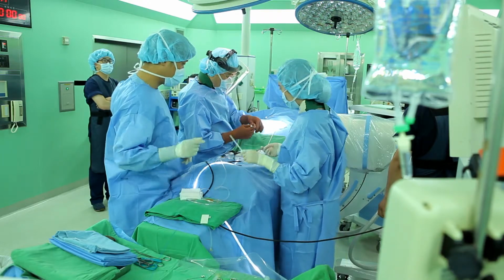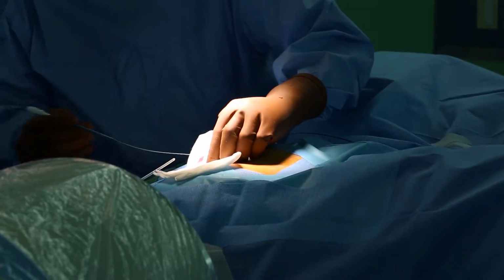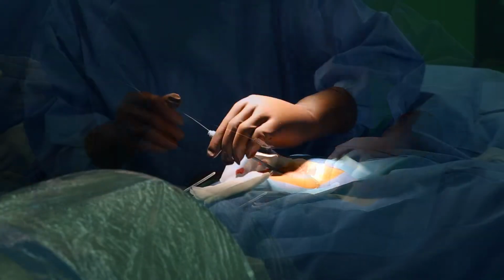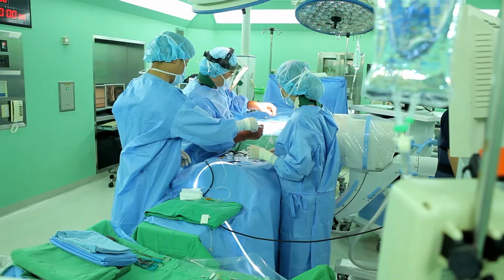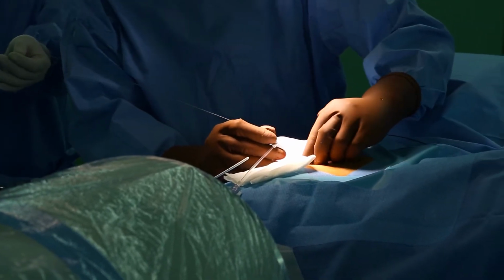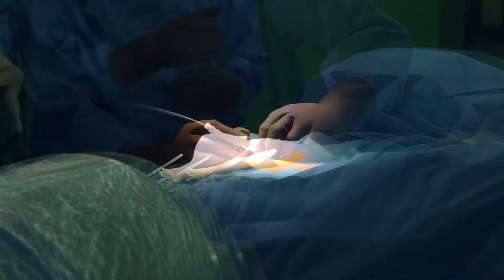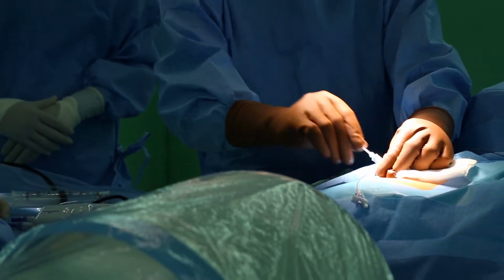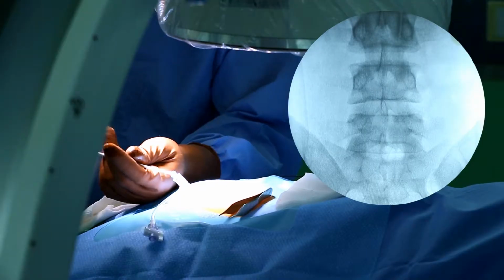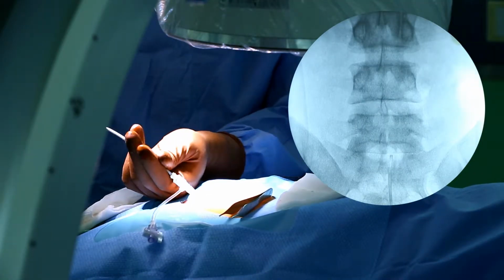Remove the needle, leaving the guide wire in the hiatus, and then the dilator is introduced over the guide wire. Remove the dilator and then put the stylet and sheath onto the guide wire. After the stylet and sheath are placed in the hiatus, take out the guide wire. Remove the stylet, leaving the sheath in the hiatus. Insert the catheter into the targeted treatment point over the sheath.